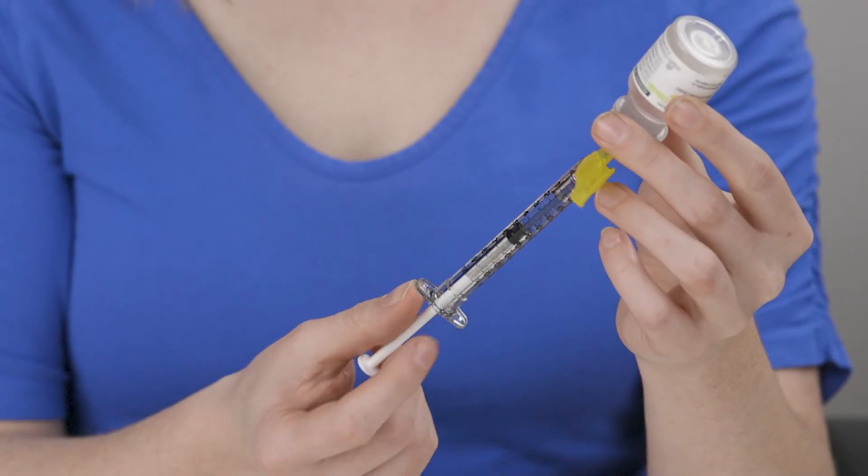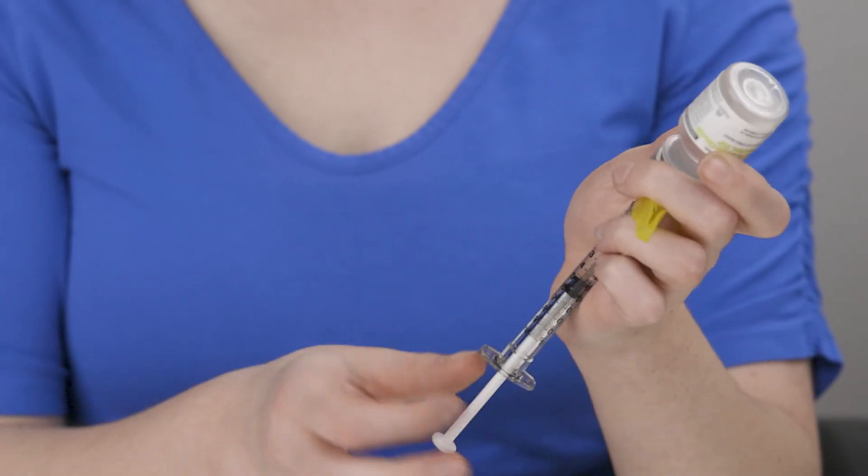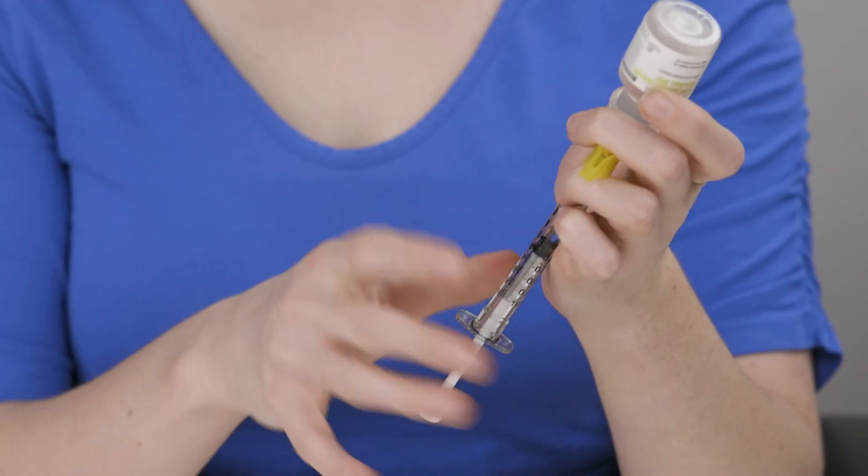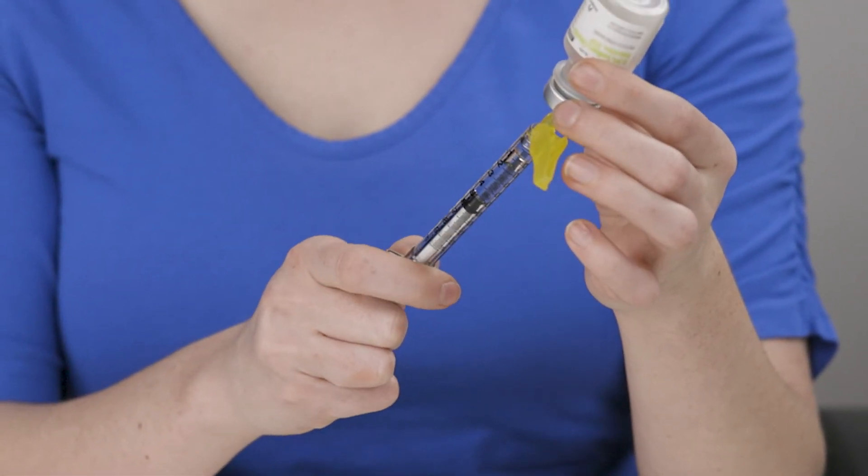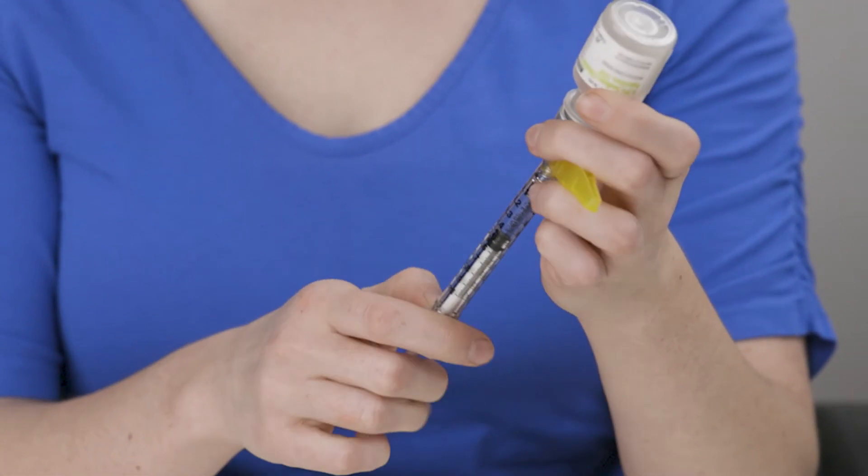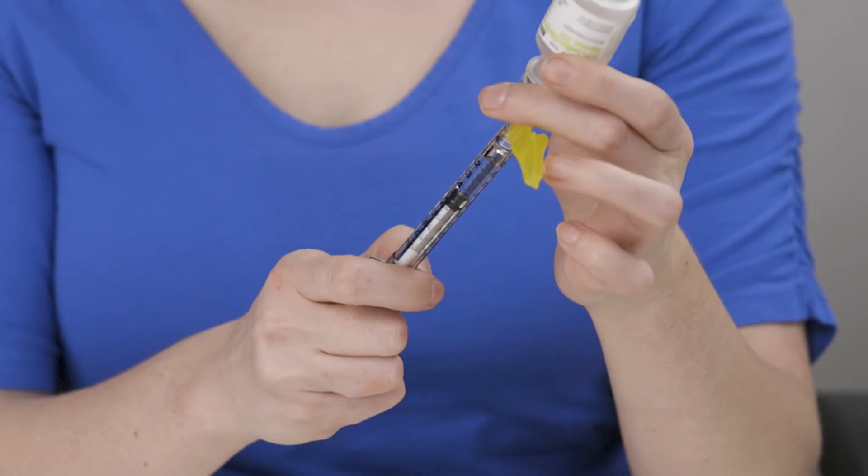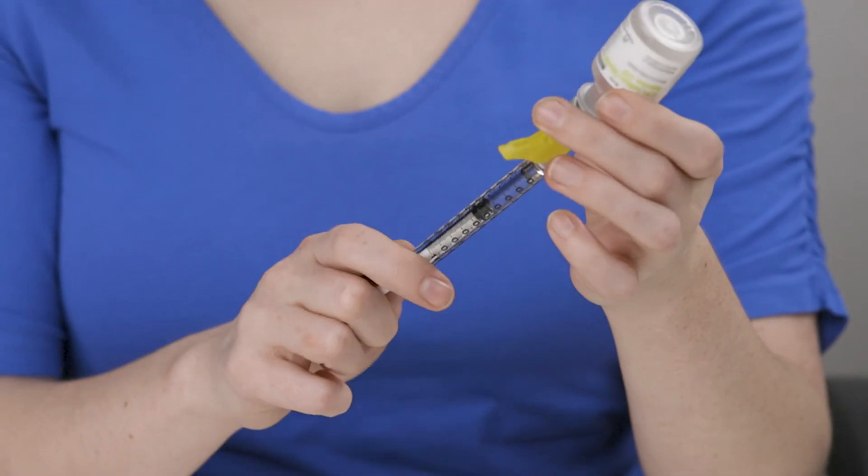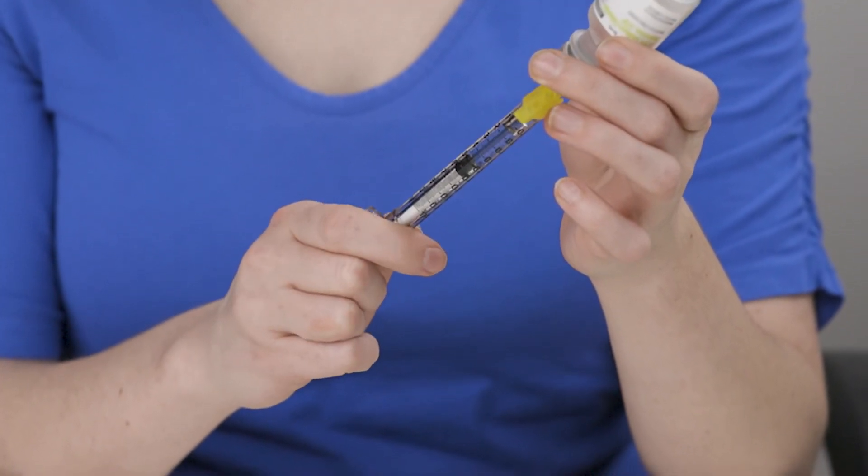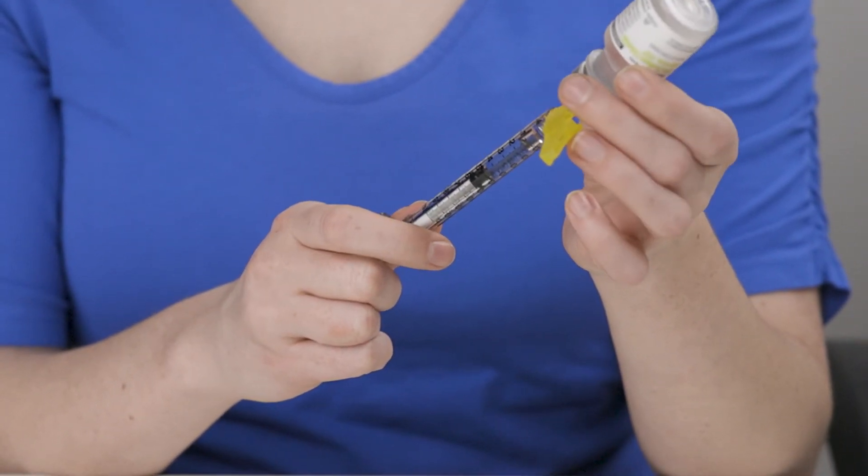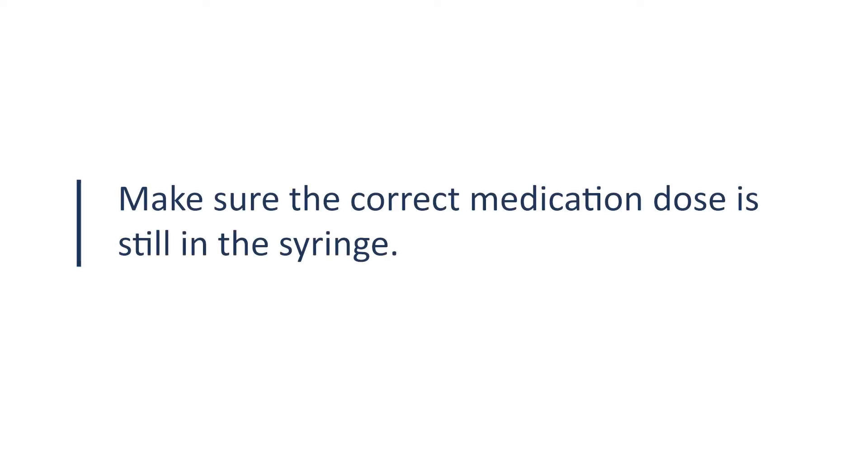If there are air bubbles in the syringe, flick the syringe with your fingers until the air bubbles rise to the top. Gently pull the plunger down and then push it back up to force the bubbles out of the syringe. Make sure the correct medication dose is still in the syringe.